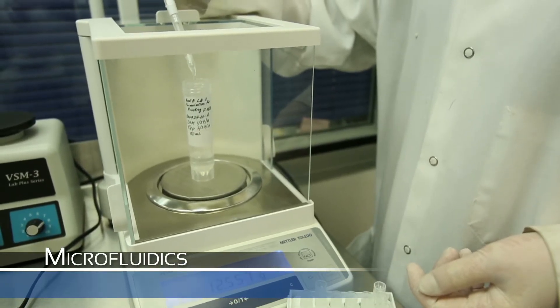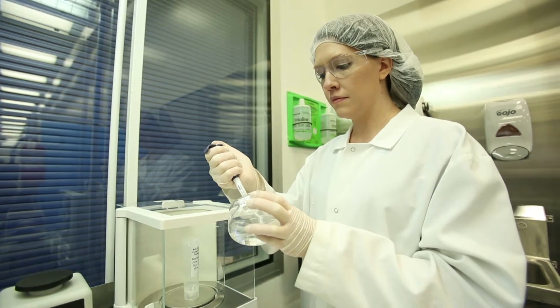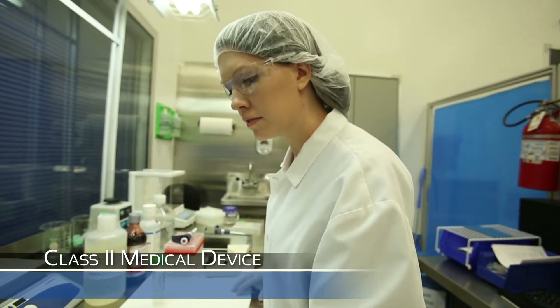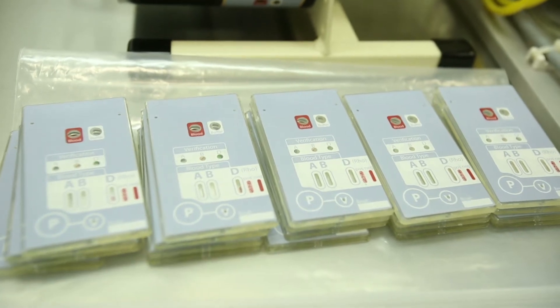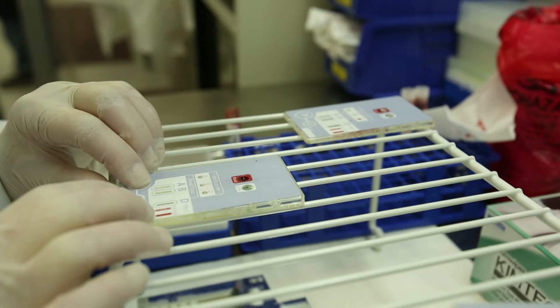Microfluidics is the direct manipulation and processing of a small amount of fluid, usually in microliters. With one of our customers, EFCO has been able to incorporate this technology into one of our molded plastic parts, resulting in a portable, easy-to-use, disposable medical device to determine an individual's blood type.